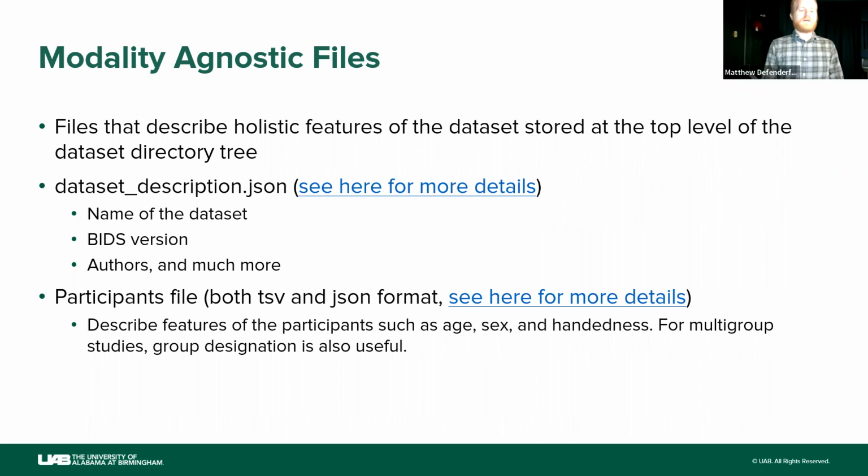All right, so that is it for the modality agnostic files. That's the very brief overview of BIDS, just to get you all familiar with exactly what it is and what it does, and what you can expect as an output whenever you're converting to BIDS. But now we should probably get into how you actually convert it.